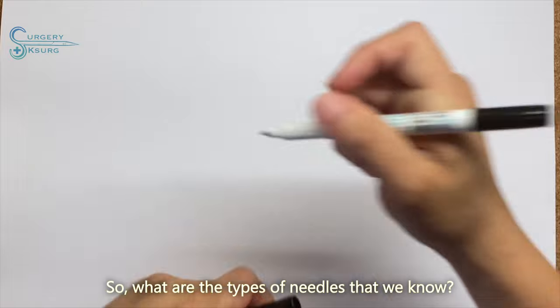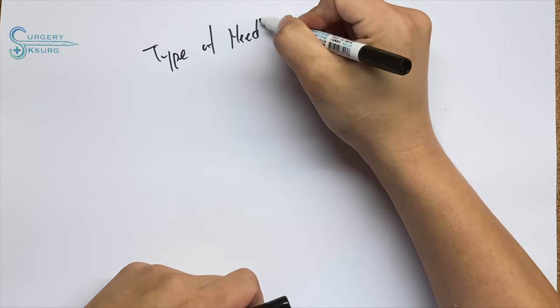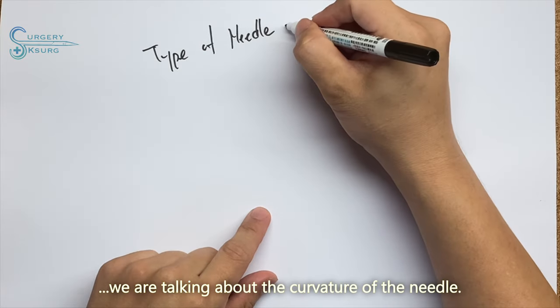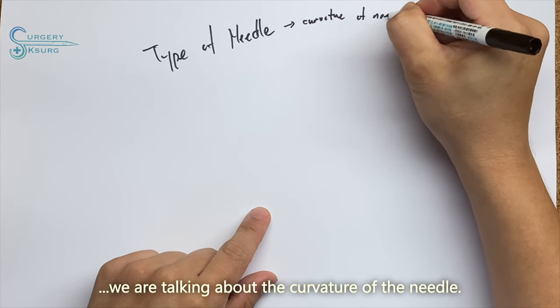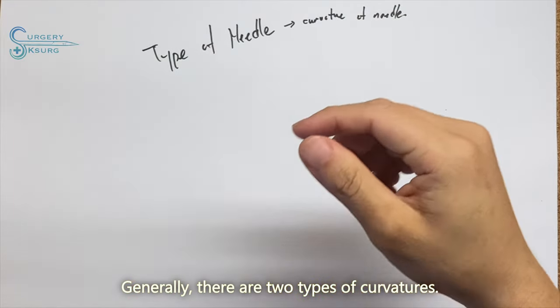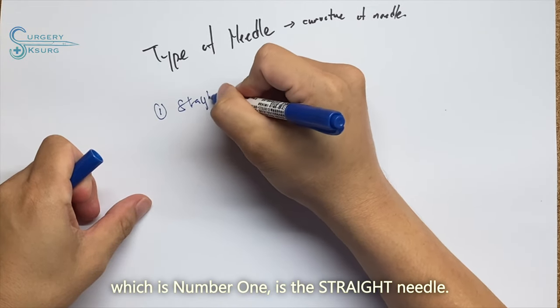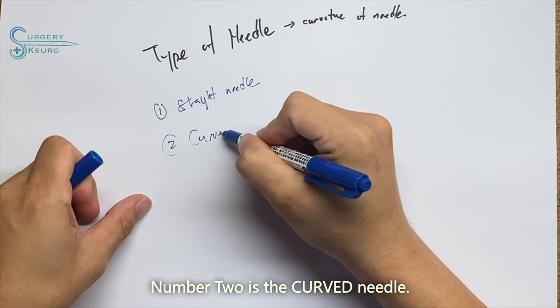So what are the types of needles that we know? Of course this is a very general statement, but when we talk about the types of needles, we are actually talking about the curvature of the needle. Generally, there are only two types of curvature. The bigger group, number one, is the straight needle, and number two is the curved needle.